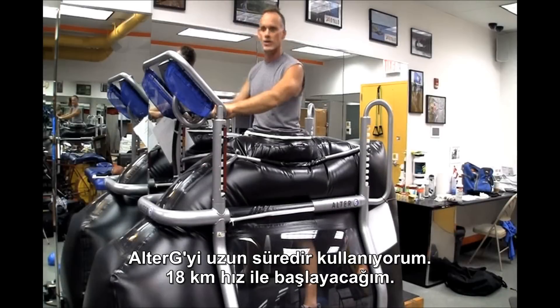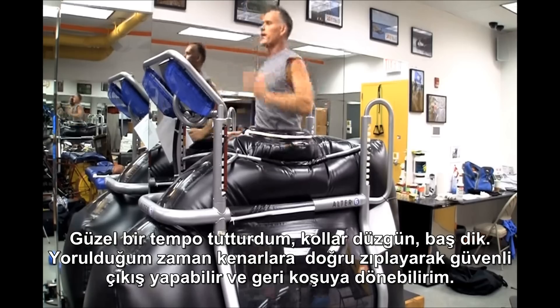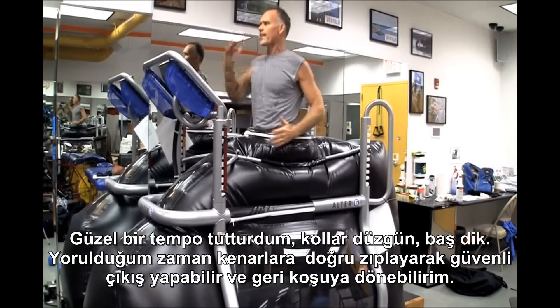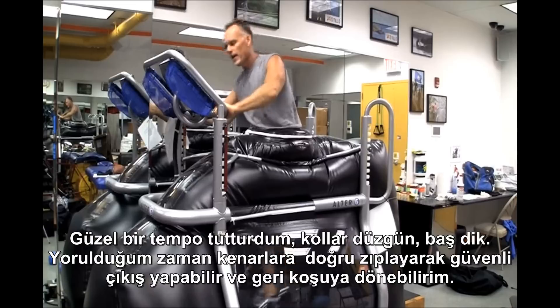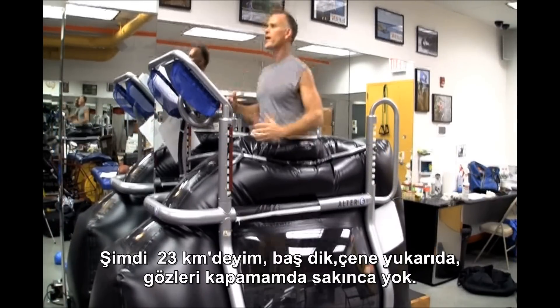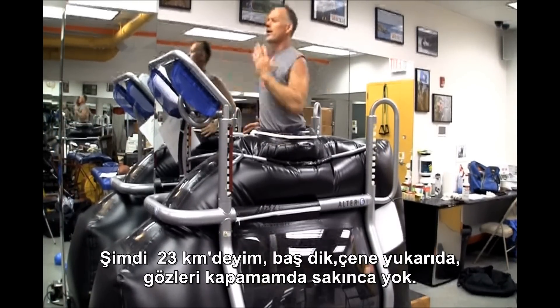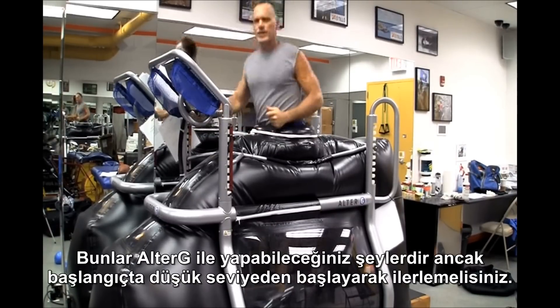I've been using the Alter-G a long time. I'm going to enter at 11 miles per hour, get a nice run going, get my mechanics head level. If I get tired, I can do that safety exit. I'm going to jump back on at 14 miles per hour — head level, chin up, safe, shut your eyes. These are things that can be done on the Alter-G.